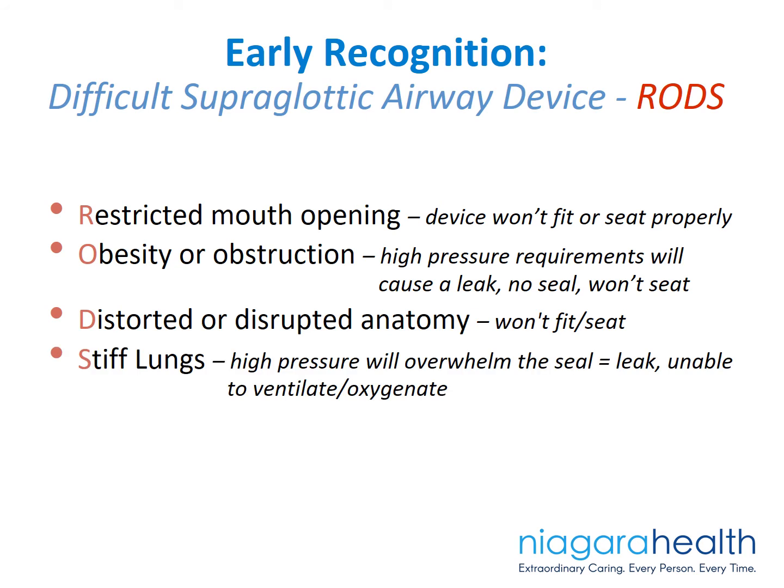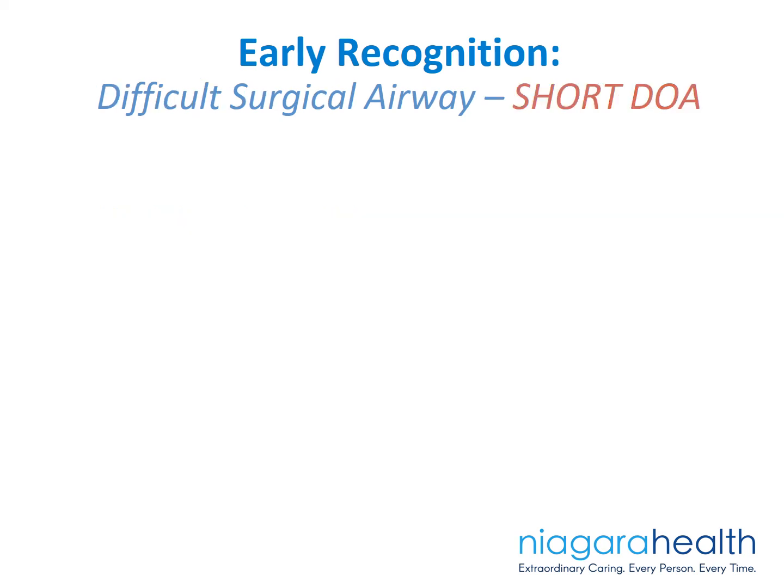Stiff lungs, you'll overpressure the device, you'll overwhelm the seal, you won't be able to ventilate or oxygenate your patient. And back to the final thing that we talked about, which is our difficult surgical airway access. That's our mnemonic SHORT DOA.